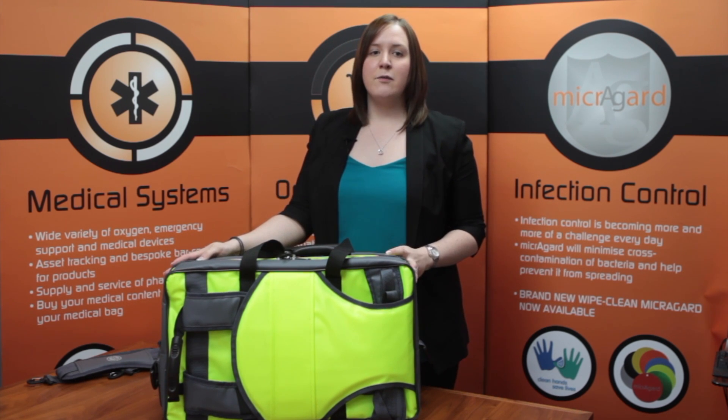This bag is perfect for community first responders. You can find more information about this bag on our website, openhouseproducts.com.